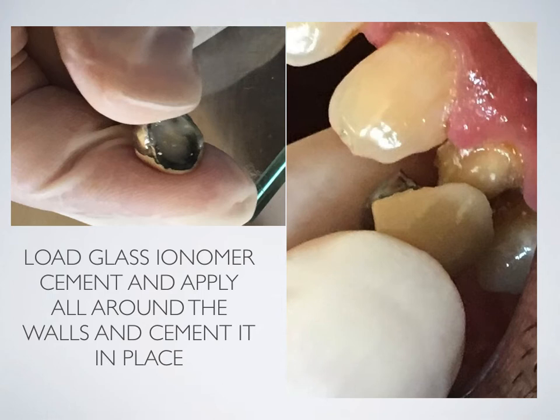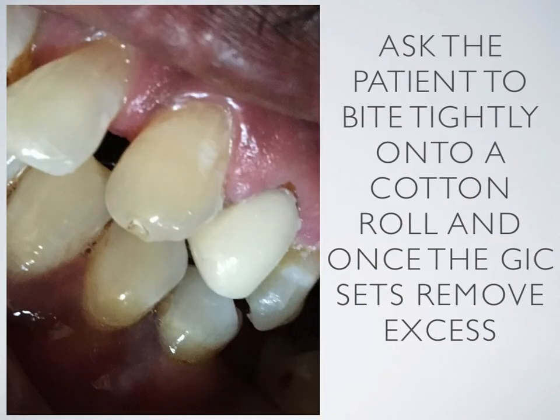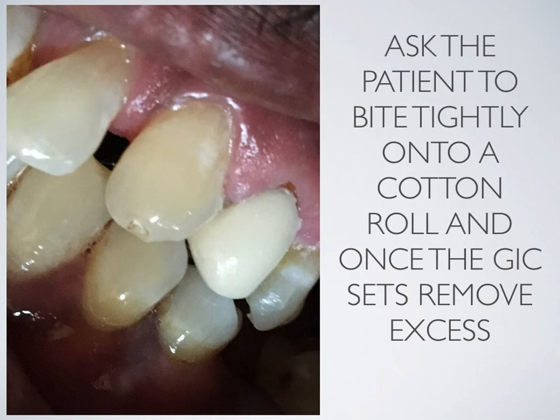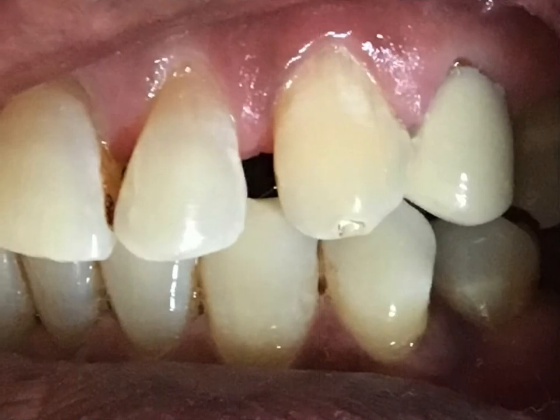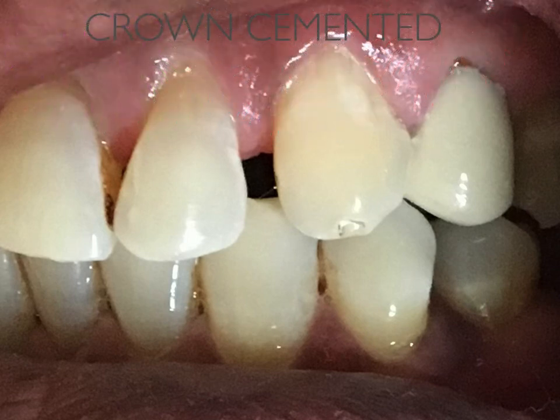Be sure of the path of insertion. Ask the patient to bite tightly onto a cotton roll, and once the GIC sets, remove the excess. This is how the cemented crown will look.